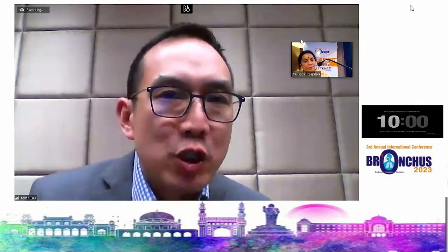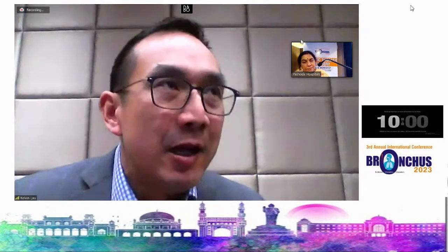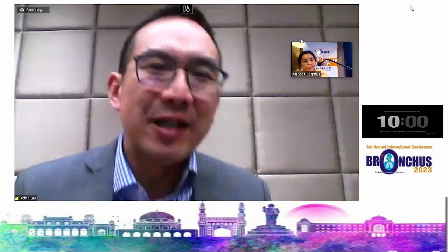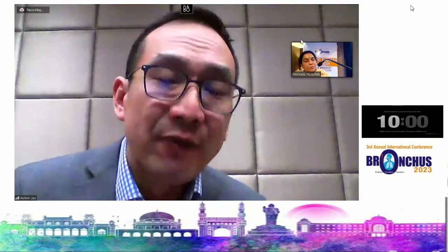It's interesting. I think the robot is actually quite good for it because certainly you get a zoomed in view, you magnify the view, and you can dissect a difficult place much better. I feel a little bit uncomfortable because I have no control of the vessels. If I need to, it's a bit more difficult to convert and run in. But increasingly, because we don't have much experience, we try to do it, and we're only at the learning curve and building up the experience. But I can see advantages to it.